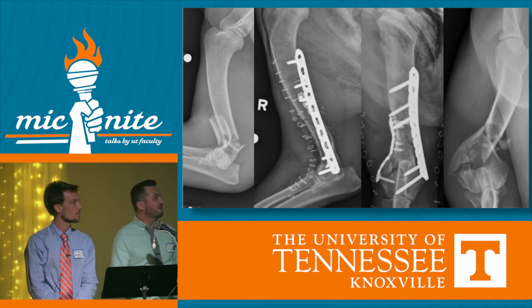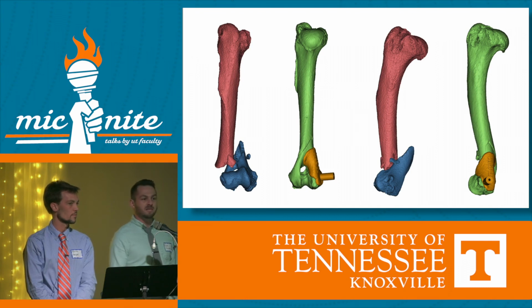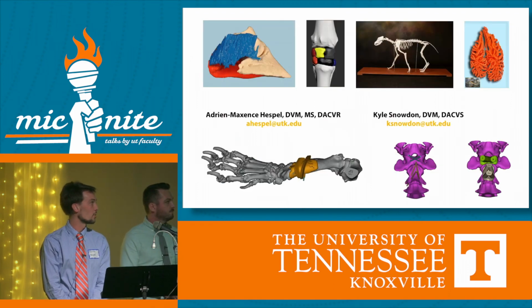Yeah, and as a surgeon, I'm very happy with this, but there's some things I could do better. This screw right here, I actually want a little bit flatter across what we call the condyle, the edge of the elbow. So in the next case, what we made was actually a custom patient-specific 3D printed surgical guide that snaps onto his anatomy and his anatomy alone that directs that screw exactly where we want it to go. So we learn a little bit for every case we do, and hopefully we can do better on each successive one. So we're still working on different research projects, and at this point the sky is the limit.